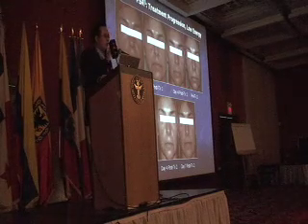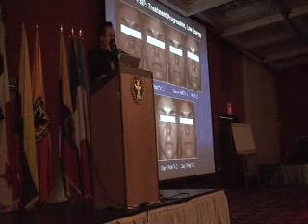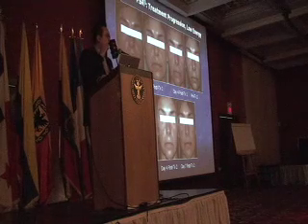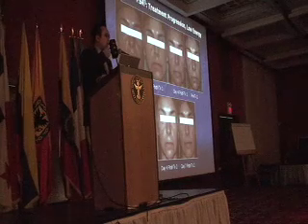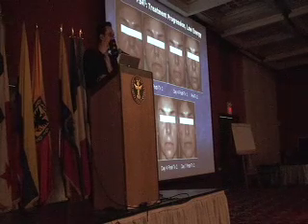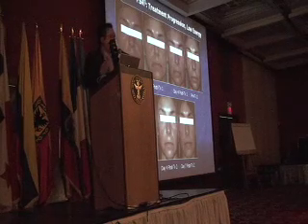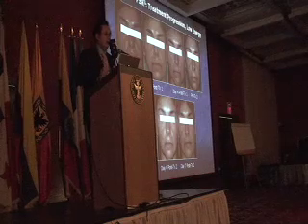One more thing that is important when you're treating the patient is to be careful keeping all the old stratum corneum intact. You don't want to scrub it away. That is a protective layer during treatment. So no facial scrubs for a week before, and when they come in, no facial scrubs at all, and just gently clean it off. You also want them not to have any kind of acetone or alcohol. This is flammable. So oxygen is turned off for the time of the treatment, and that's very, very important as well.